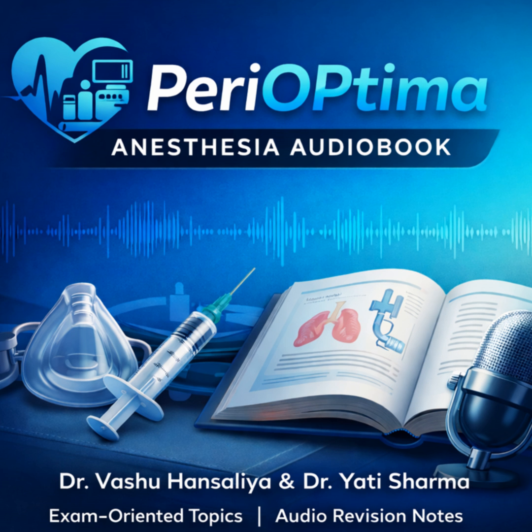And the primary cause of this is the cuff pressure, correct? Precisely. Excessive cuff pressure exerts force on the surrounding pharyngeal and laryngeal mucosa. This leads to mucosal trauma, edema, and subsequent pain. This leads directly to the exam-critical preventive measure: the absolute necessity of maintaining cuff pressure within the recommended therapeutic range of 40 to 60 centimeters H2O.